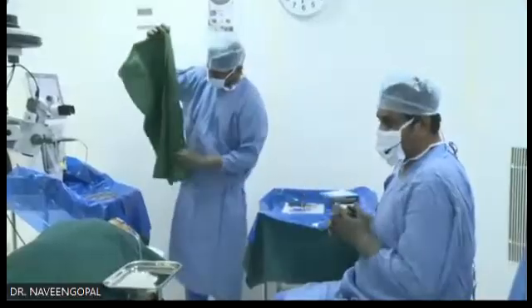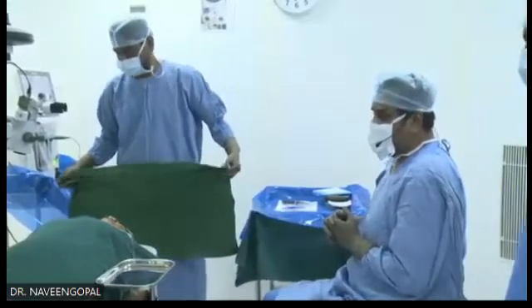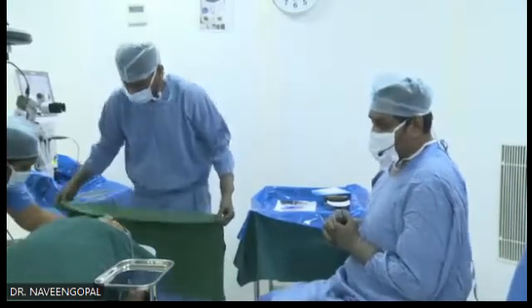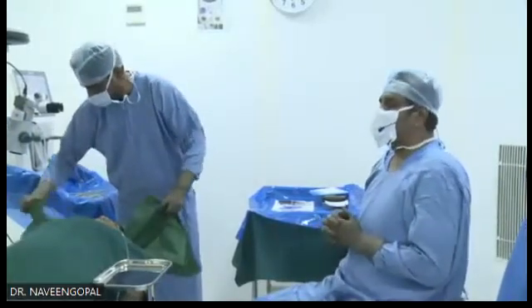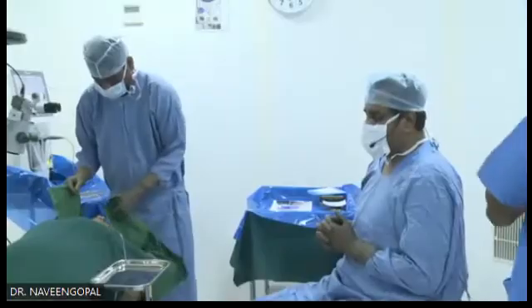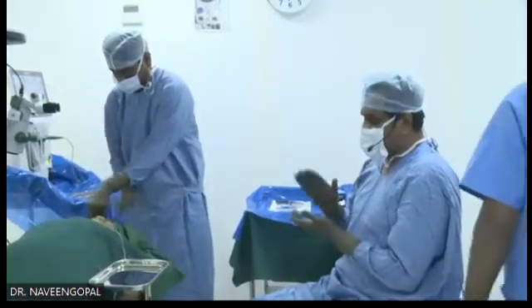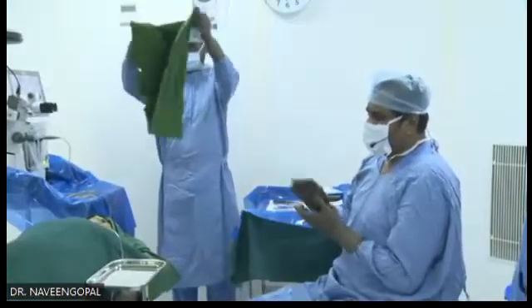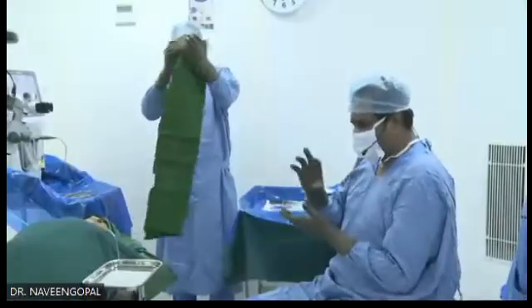Both are challenging for the phaco surgeon, especially with a small rhexis, which has to be a criterion for a multifocal or toric IOL. I always prefer hydrophobic, whether multifocal or trifocal, whatever I'm putting. I prefer hydrophobic because it immediately sits and attaches itself to the posterior capsule. It doesn't move. The hydrophilic, especially with plate haptics or double haptics or modified C haptics, keeps moving.